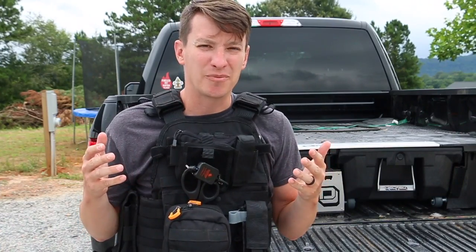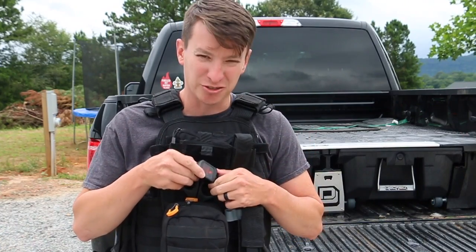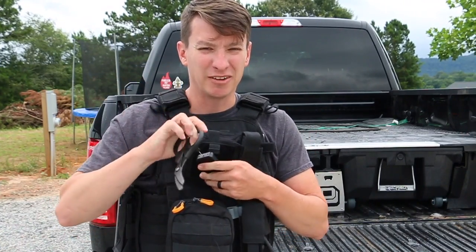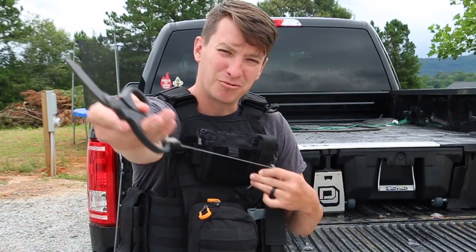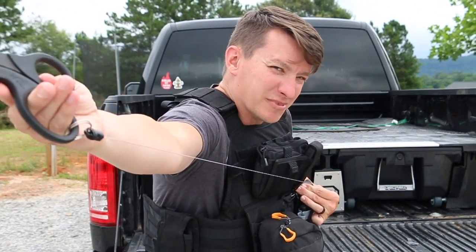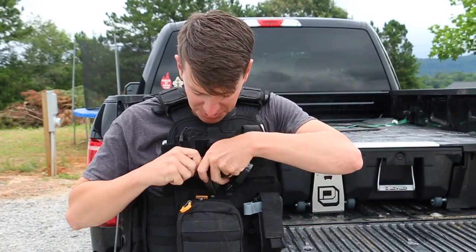So I'll be honest with you, I'll tell you how I've been carrying these. They're attached to my tactical vest. I have them attached via North American Rescue scissor release here, so that way if I drop them or something happens, they're still attached. And you still have plenty of room to reach out and to use them, and then you don't lose a nice pair of scissors.